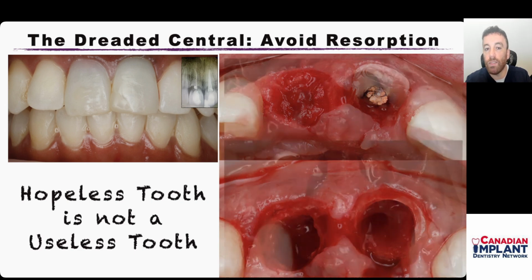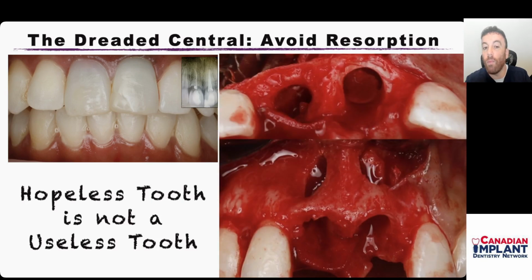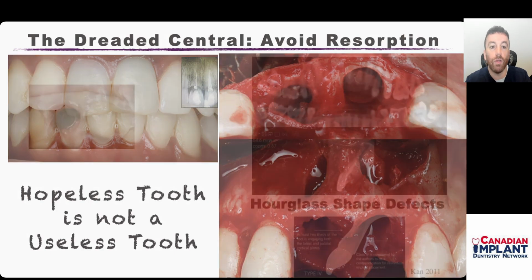So what can we do in this kind of case? We don't just go and pull the tooth entirely, knowing the consequence of resorption. We end up performing what we call a socket shield procedure. In this case, because there's not good bone to anchor the implant into, we do a modified version of that, which is called the Glocker approach. So in this case, we go ahead and perform socket shield therapy, wrapping around the line angles in order to get increased surface area and retention of that shortened root.